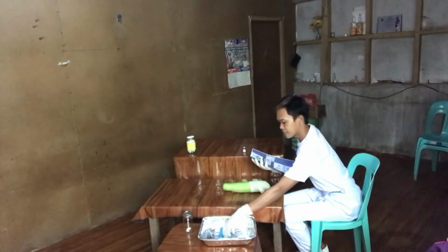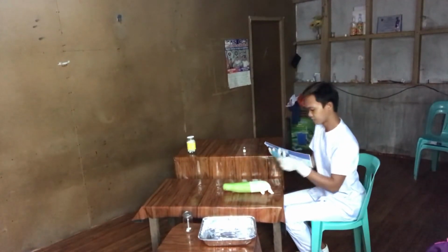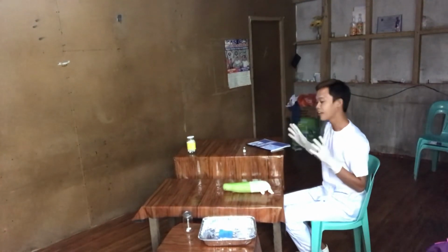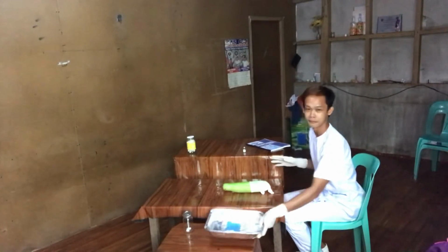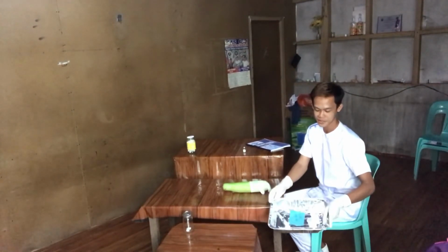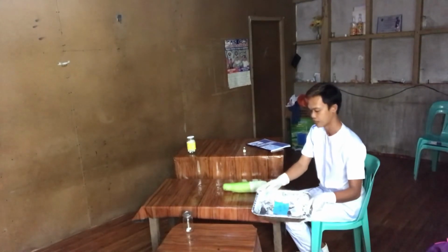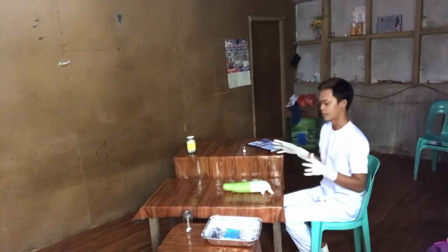Check the medicine ticket. Then arrange the medication tray on the hypodermic tray. Here is the equipment that you need for the administration of medicine through the intramuscular route.